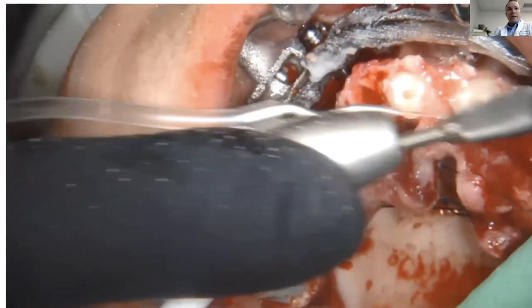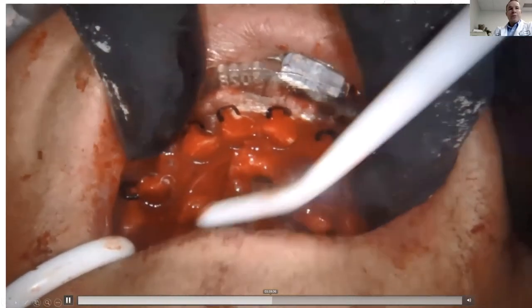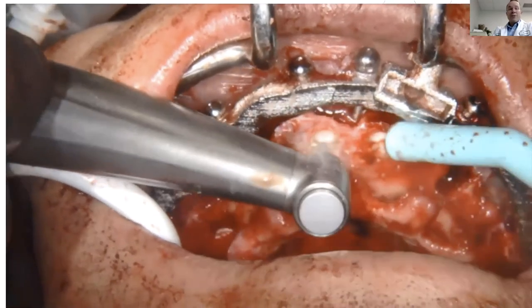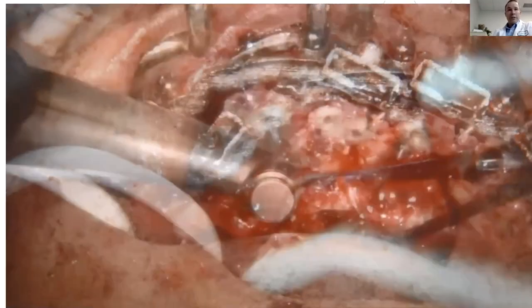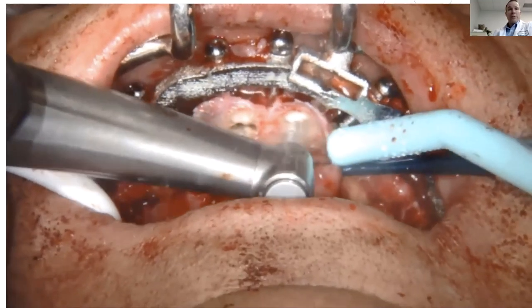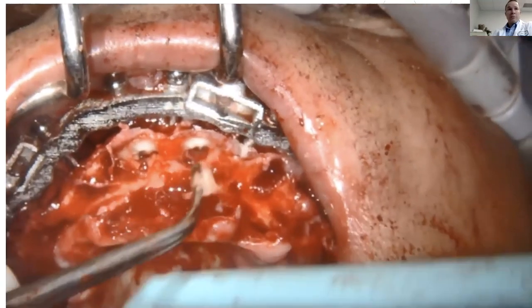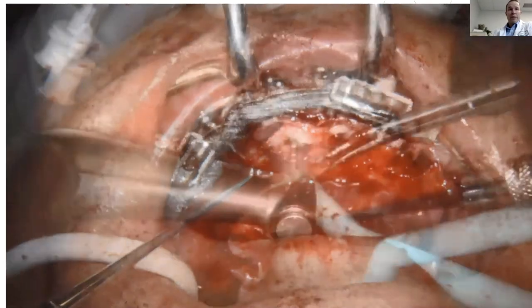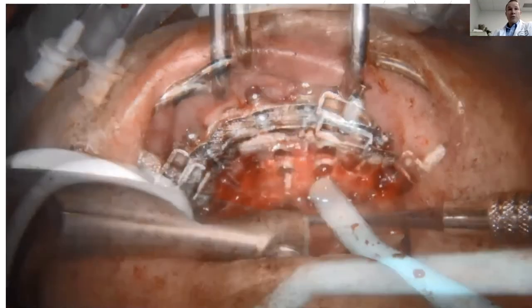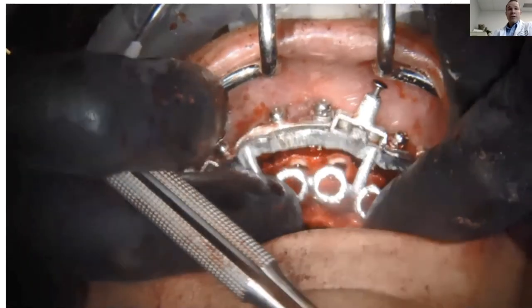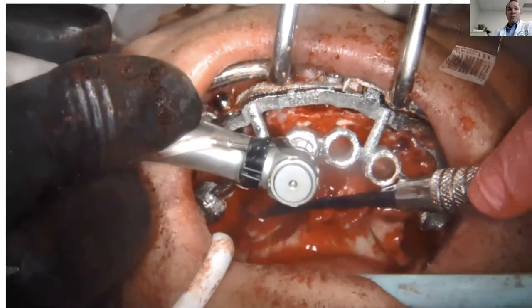Continue adjusting bone down to the level of the fixation base, then also adjusting the PET roots. Adjust everything until you can feel a smooth transition with your finger, then try in the carrier guide to confirm it's passive. Bone reduction time varies significantly — we've been in cases where tooth and bone reduction took an hour to two hours. In our opinion that's probably too long. Use an aggressive burr; James uses a comet burr nicknamed the 'Mr. Hungry' burr. For some doctors, 10 minutes of work takes another doctor an hour and a half, based on tools and technique.